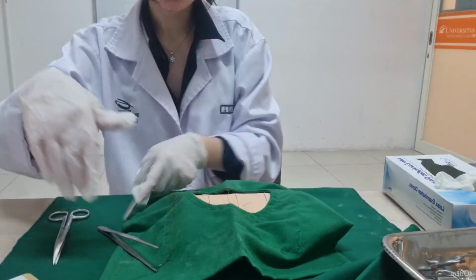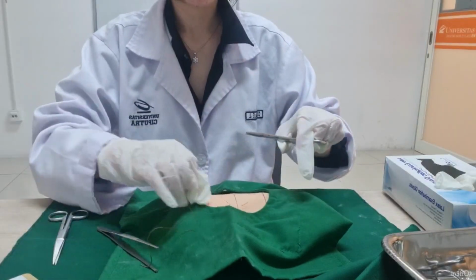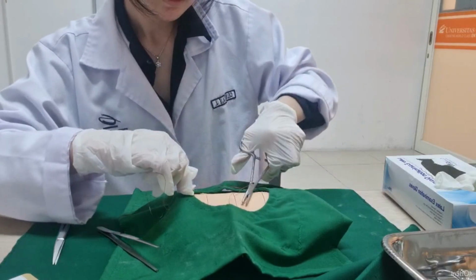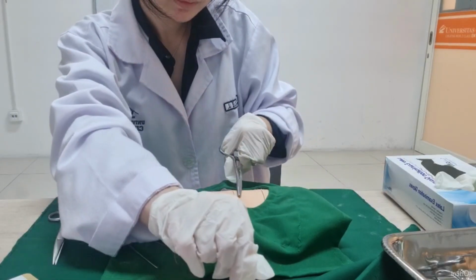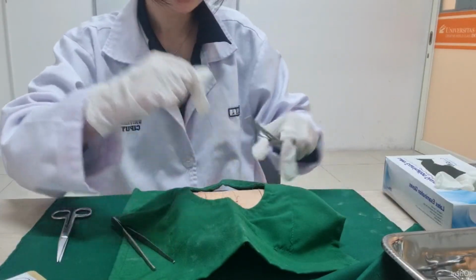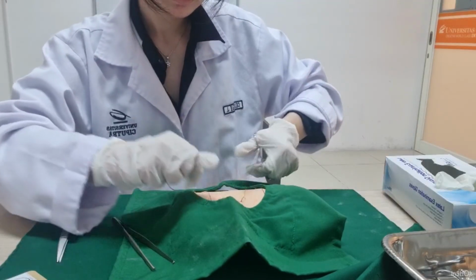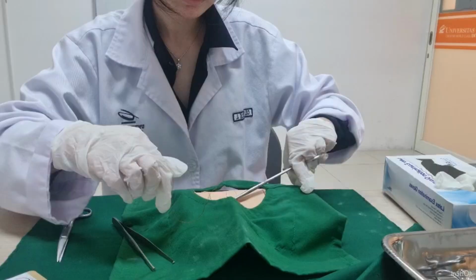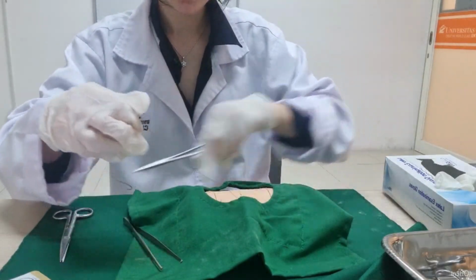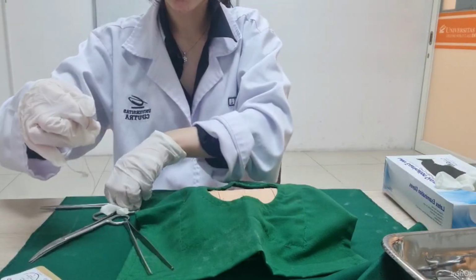Okay, so next I will tie a knot. Tie it once more so that it is secure. Okay, so I will cut it now and move on to the other one.